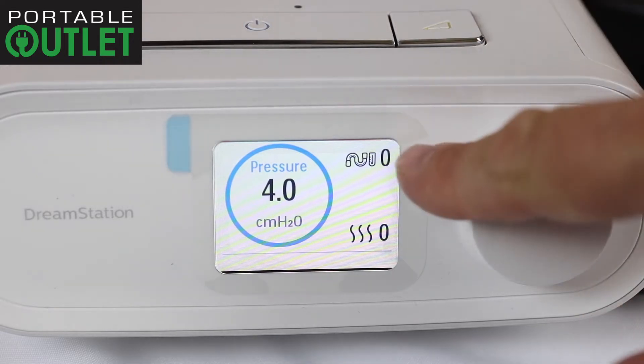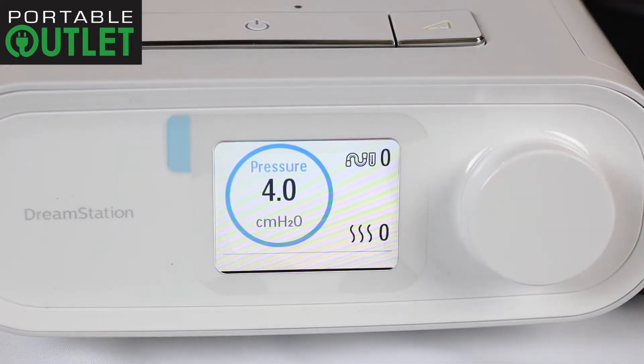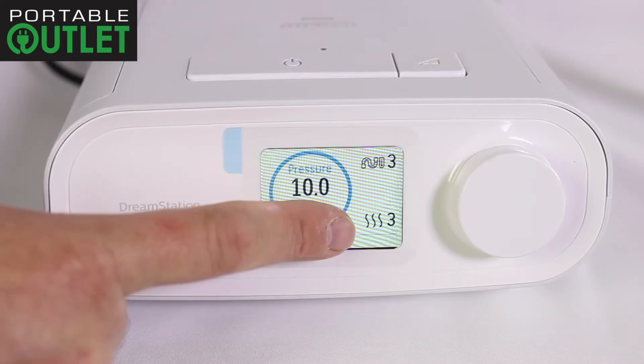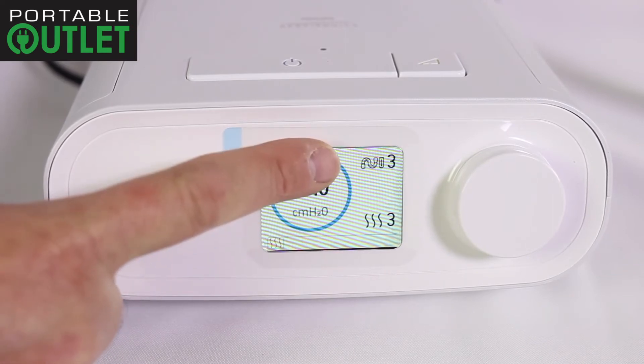When finished, you will see both the heated tube icon and the humidifier icons read zero, and that is how to maximize battery life on the Respironics DreamStation CPAP, AutoPAP, and BiPAP systems. The best way to maximize your CPAP battery life is to turn off the heated tubing and heated humidifier.